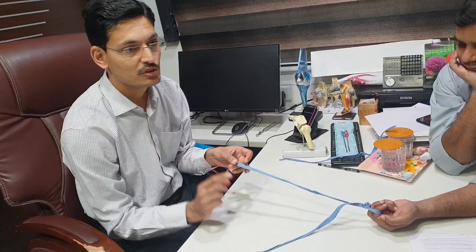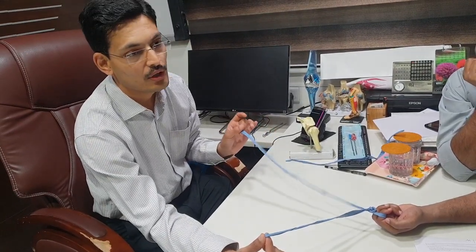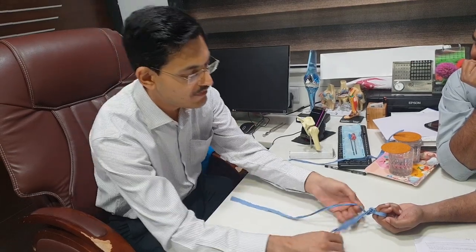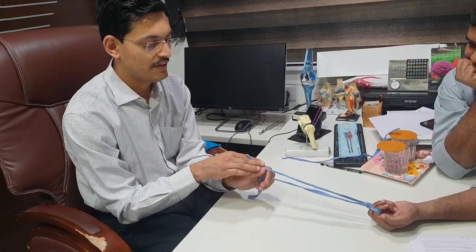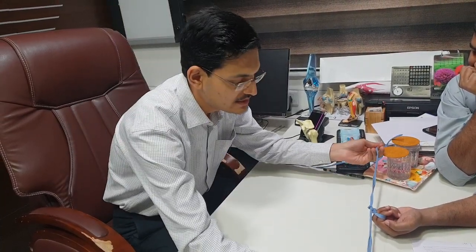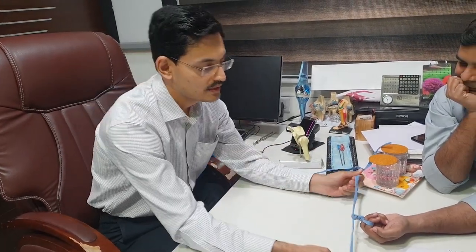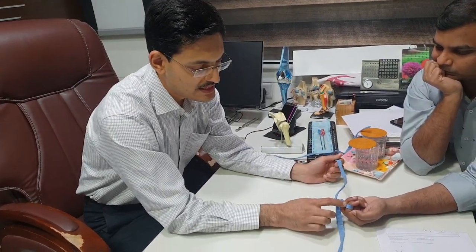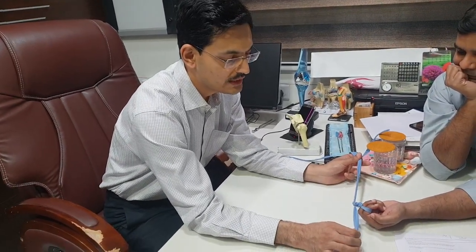Sliding with one strand and locking with the other strand — once you lock it, sliding will not be possible. This is a sliding locking knot. After the first knot, you can make two or three half hitches. One SMC knot followed by one, two, or three half hitches is usually what completes a solid sliding knot.